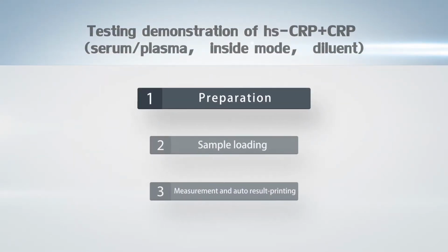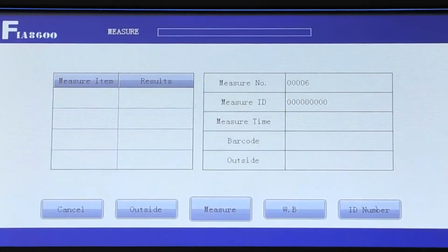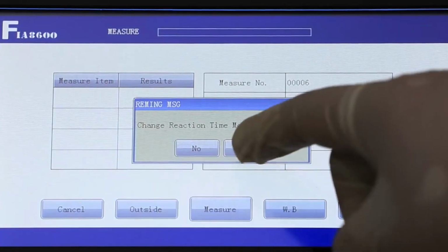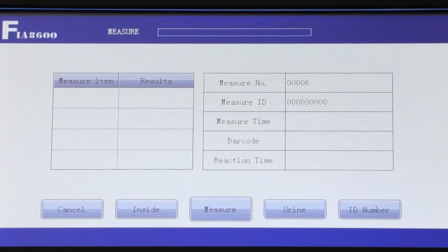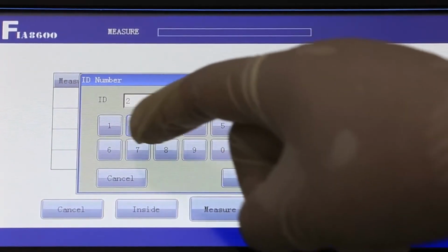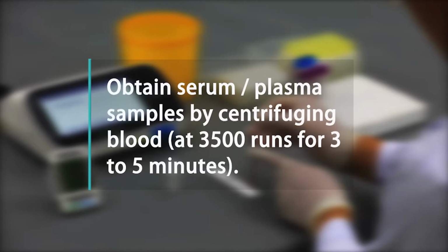Testing demonstration of HSCRP. Step 1. Preparation. Set up the parameters. Press Measure to prepare test. Choose Inside Mode and switch sample type to serum plasma. Type in an ID number of a testing sample or scan sample barcode with the scanner. Sample processing. Obtain serum plasma samples by centrifuging blood.